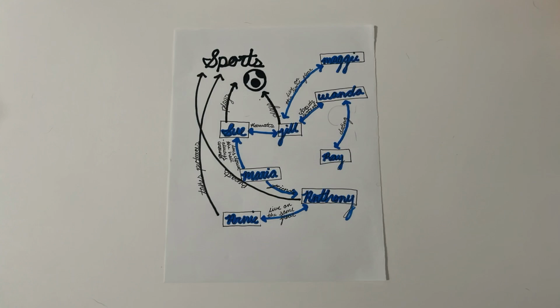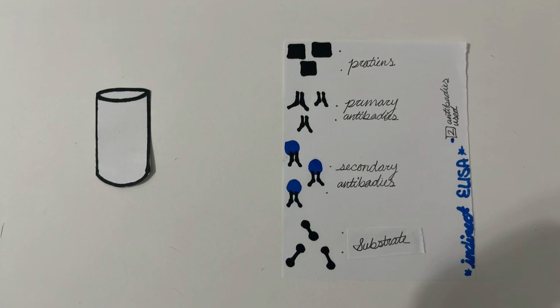How is it connected to the dorm room outbreak? The ELISA test is being used to find out who in the dorm room is testing positive for bacterial meningitis. The steps of the ELISA test.